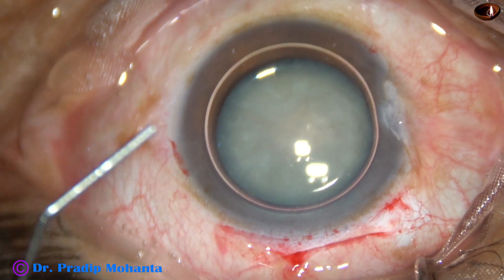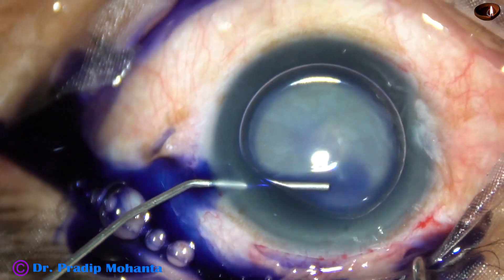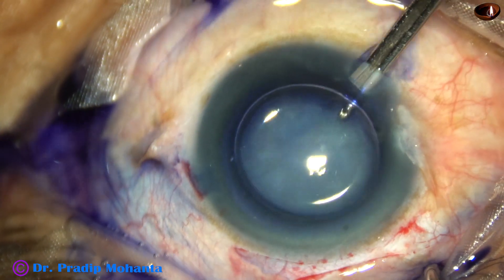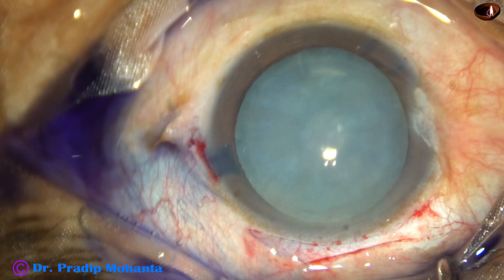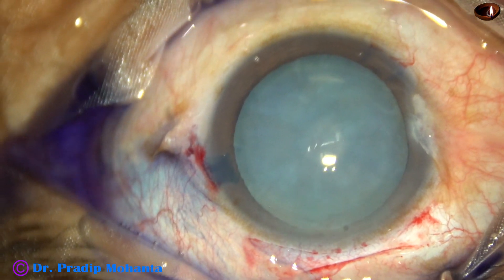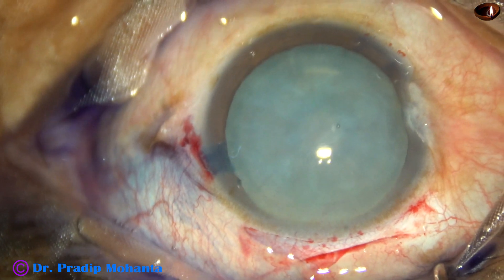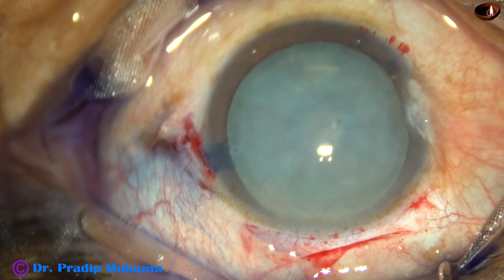An air bubble has been injected and the dye is injected underneath that air bubble. The staining is very good in a short period of time if you stain the capsule underneath a big air bubble — see, this is real time and after five or six seconds the capsule is so nicely stained. If you don't stain under the aqueous, you will have to wait for a longer time and even then the staining may not be so good.